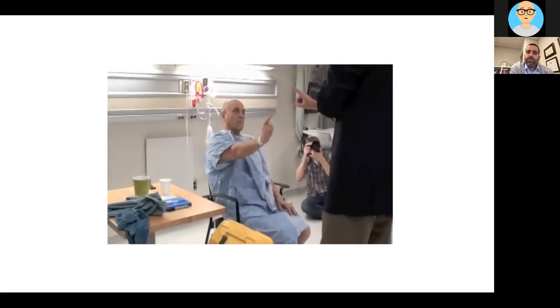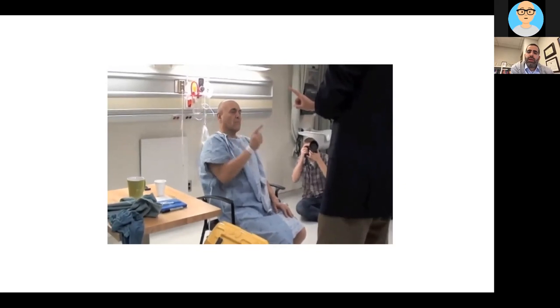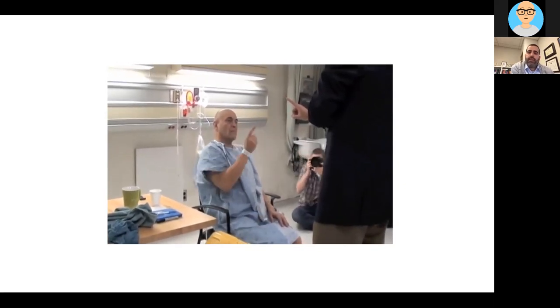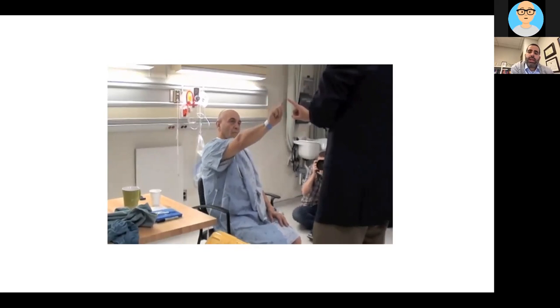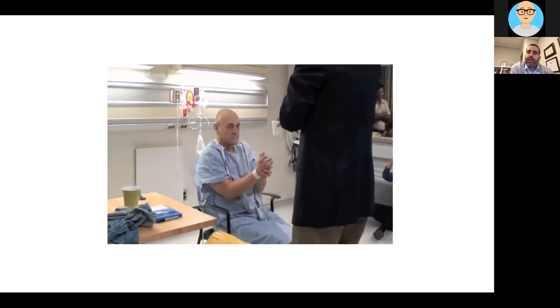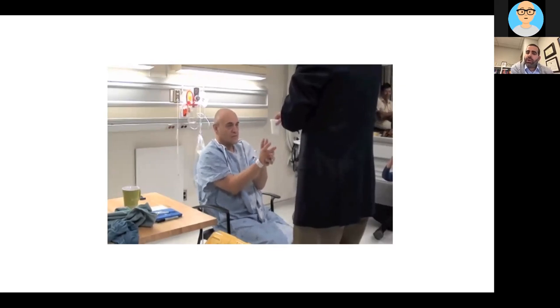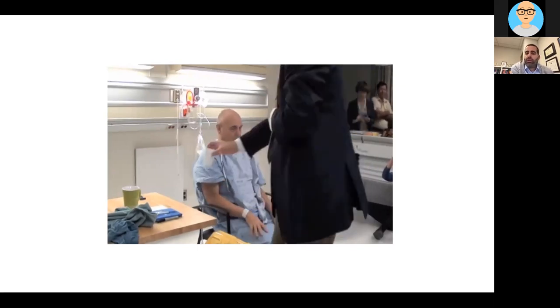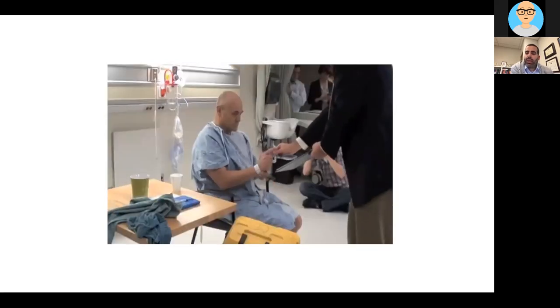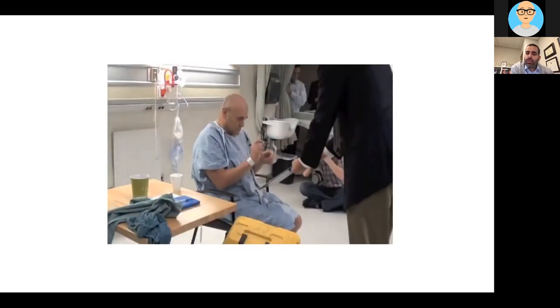As you can see, it affects both sides of his body. He wanted the right side treated, the right arm, but he did not want any open surgery. He did not want a brain implant. He did not want radiofrequency, and he did not want radiation. So he became one of the first patients in our trial of focused ultrasound for the application of essential tremor.